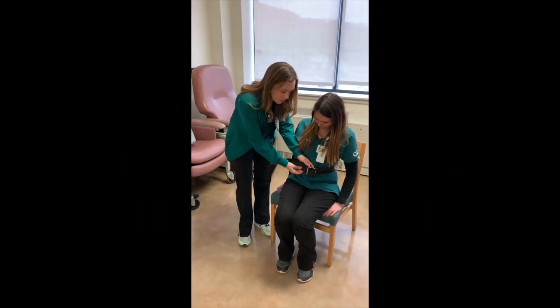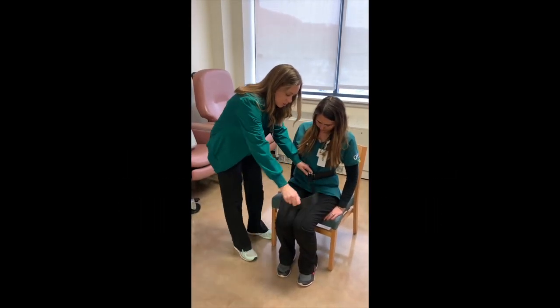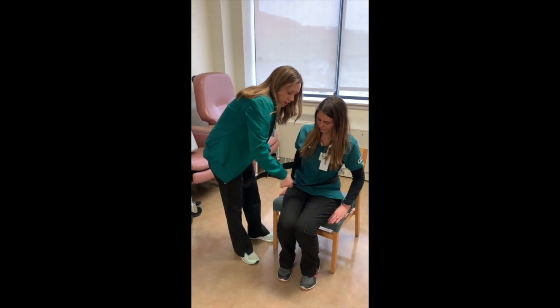I'm gonna go over a few additional tips that might help you when using a gait belt.